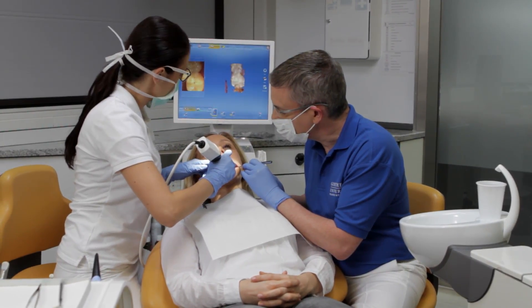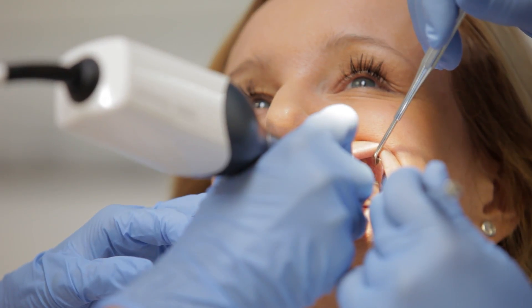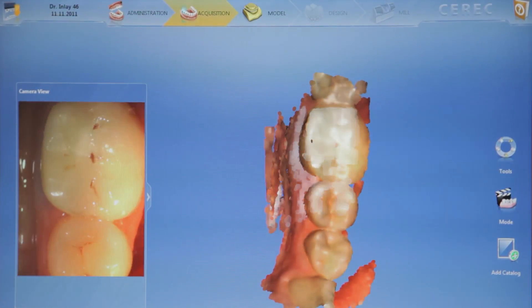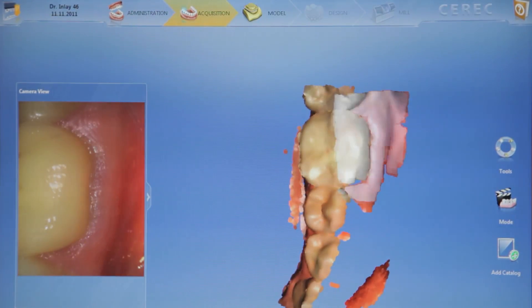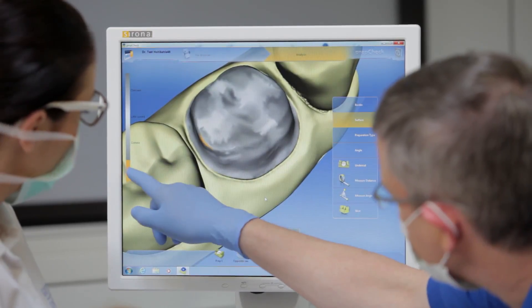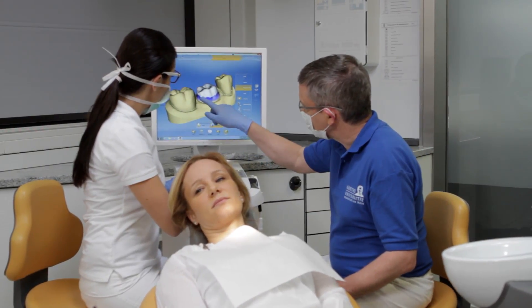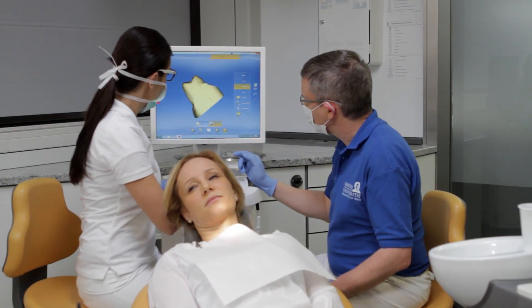Thanks to its advanced mode, PrepCheck can be smoothly added to clinical training. On the patient, PrepCheck enables preparations on every natural tooth to be scanned, measured and analyzed. A key function is analysis of the situation in the patient's mouth in comparison to selected parameters – that is, distance to the antagonists and preparation angle.